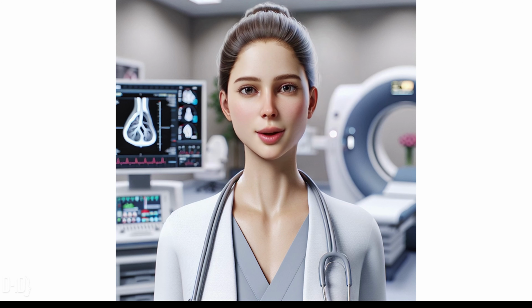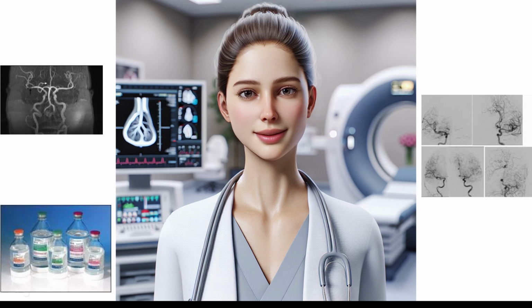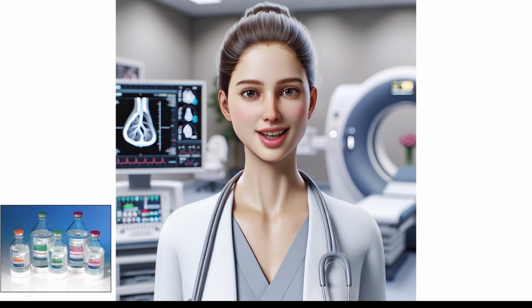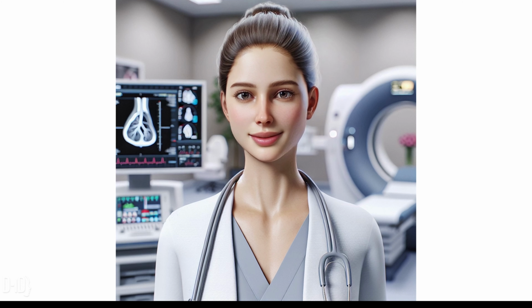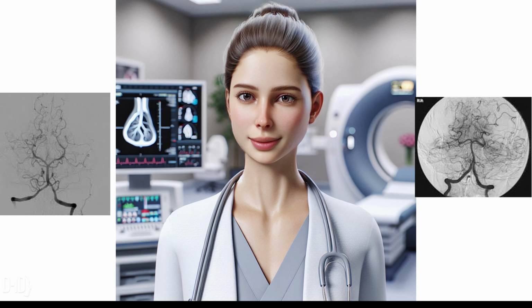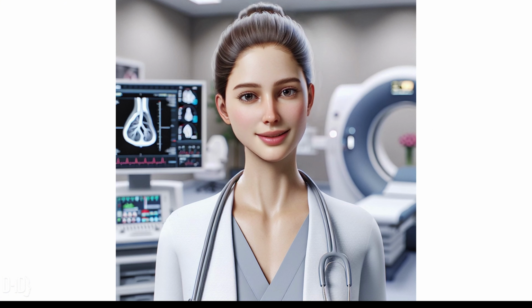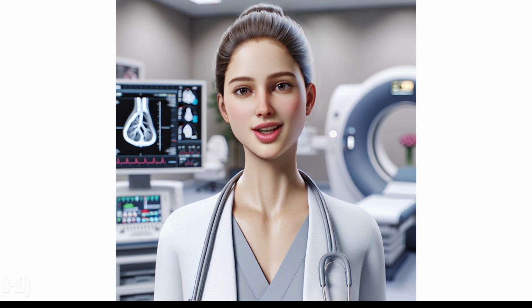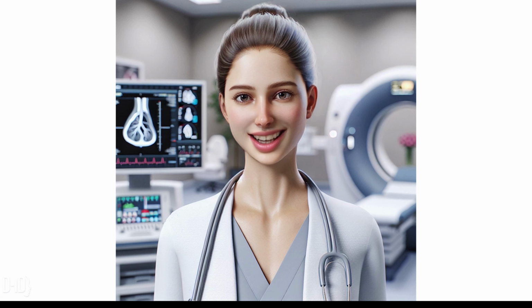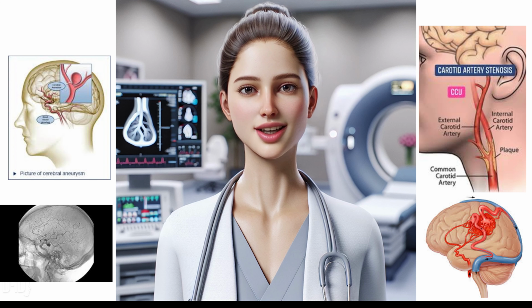Contrast injection. Once the catheter is properly positioned, a contrast dye, also called contrast medium, is injected through the catheter into the arterial system. The dye makes the blood vessels visible on X-ray images. Multiple X-ray images are taken as the dye moves through the vessels, helping the physician assess the condition of the brain's blood supply and detect any abnormalities such as aneurysms, stenosis, or arteriovenous malformations.